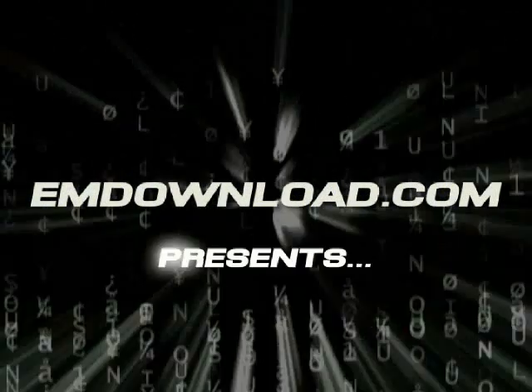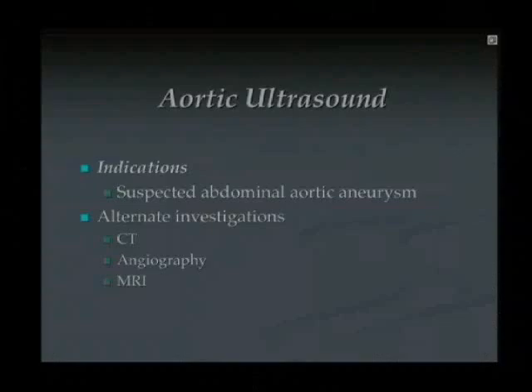This talk is going to concentrate on finding aortic aneurysms. Sit back and learn. This is an ultrasound that really can't wait till the next day. Whether we do a CT or an ultrasound, the focused question of whether that patient has an aneurysm has to be answered right then and there, that night, that morning, whenever.